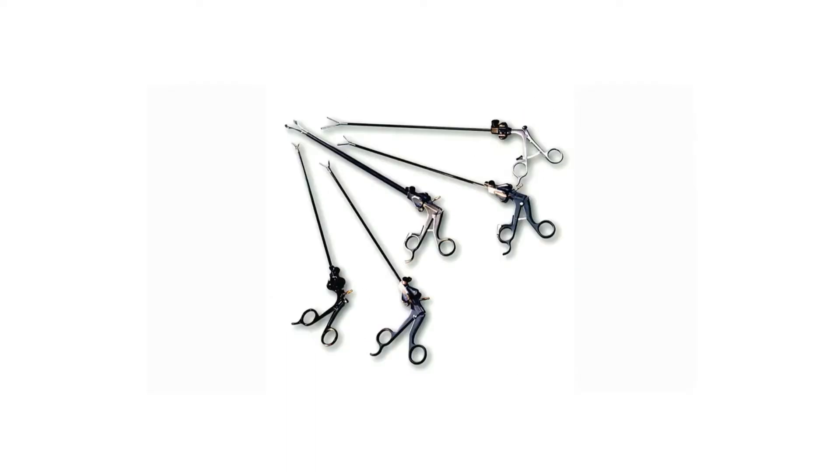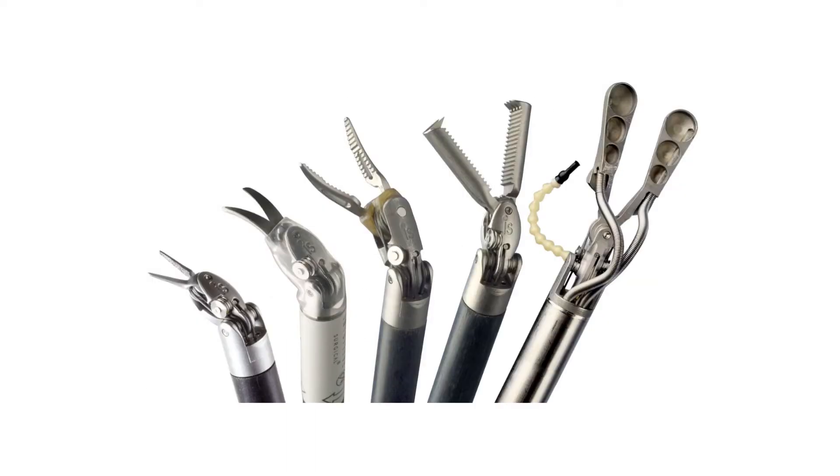These include minimally invasive surgical instruments, laparoscopic devices, and robotic surgical attachments.